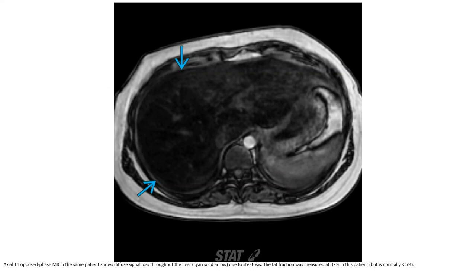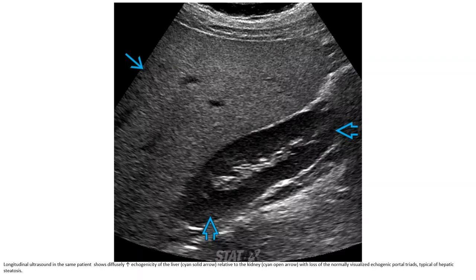The fat fraction was measured at 32% in this patient. On ultrasound of the same patient, there is diffusely increased echogenicity of the liver relative to the kidney, with poor visualization of the echogenic portal triads, typical of hepatic steatosis.